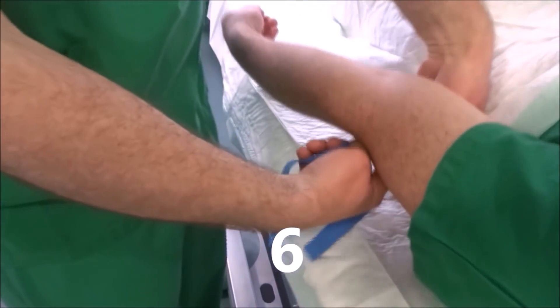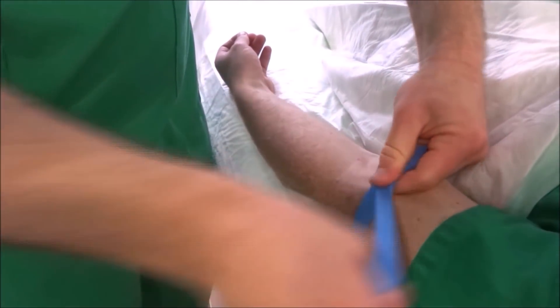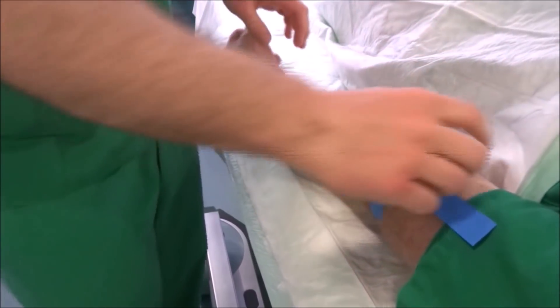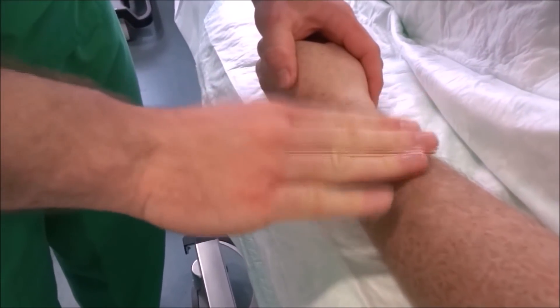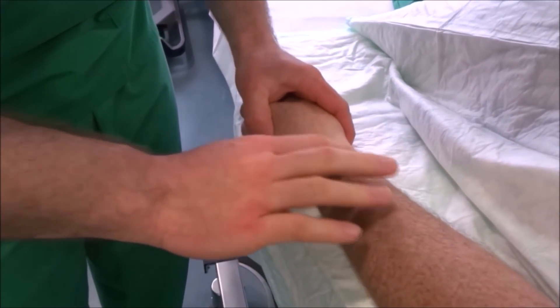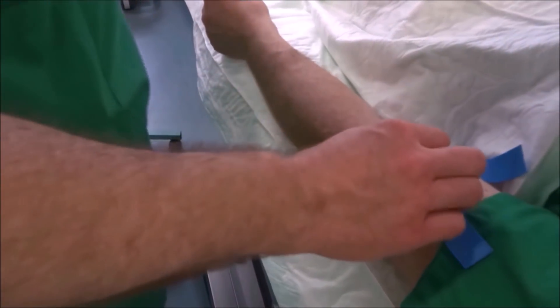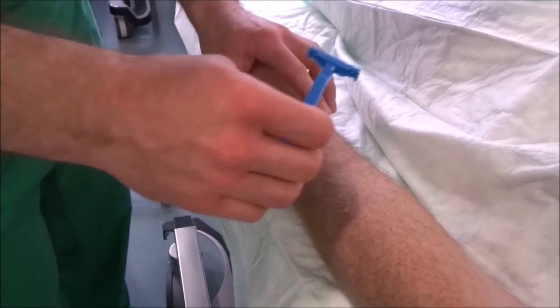Then we put the tourniquet on. We locate the puncture site. As point eight, we release the tourniquet. If necessary, we shave now on the puncture point.